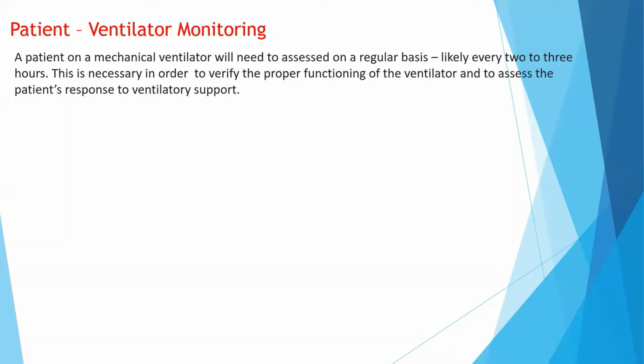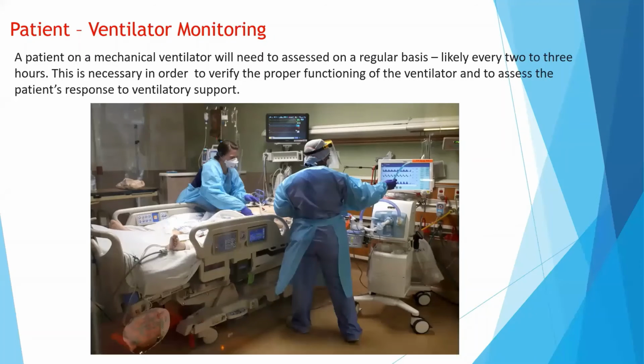Patient ventilator monitoring. A patient on a mechanical ventilator will need to be assessed on a regular basis, likely every 2 to 3 hours. This is necessary in order to verify the proper functioning of the ventilator and to assess the patient's response to ventilatory support.